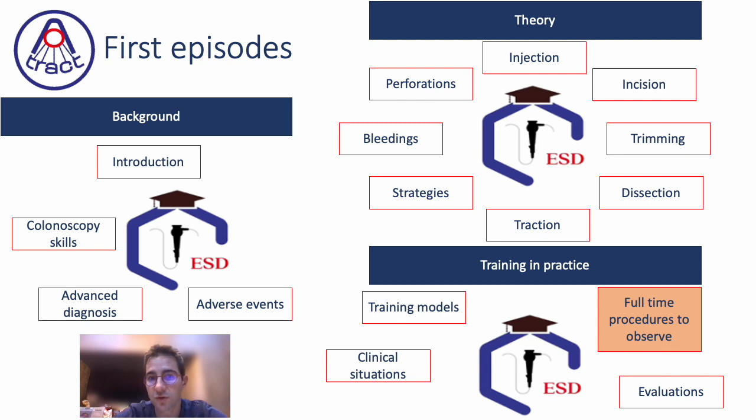And it can also be training for the endurance you should have for this kind of technique, because the procedures are longer than what we are used to with conventional techniques. So here we are.